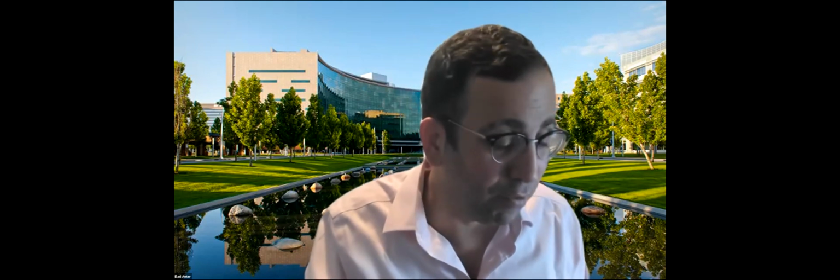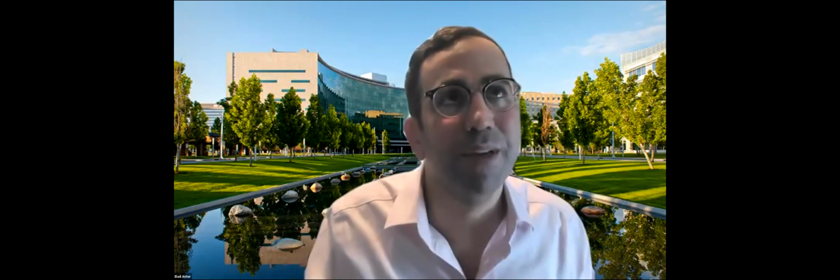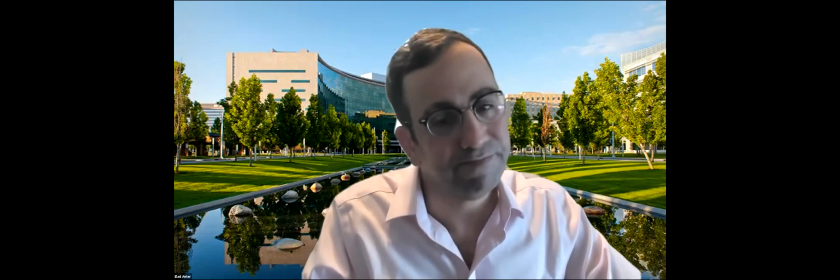I think that your observation is absolutely right, but I think it does give you another layer of information. Yeah. Well, speaking of layers, I think back to Sanjay's very insightful original question, these prolonged electrograms, I think, are composite recordings. I don't have hard evidence on this, but I know in some instances that there is an isolated diastolic potential that's buried within the rest of an electrogram from other layers, or you're recording from such a large area of tissue that you're recording from some stuff on the other side of the corridor barrier.